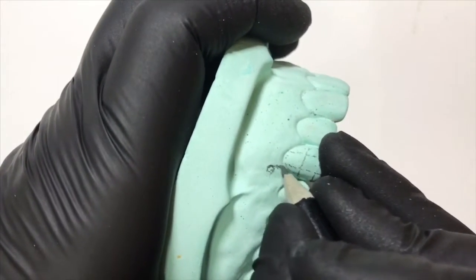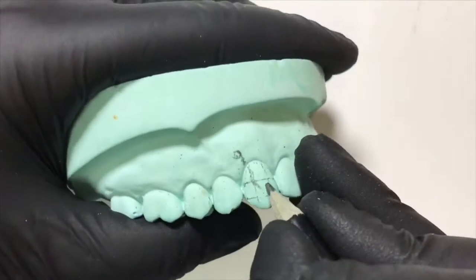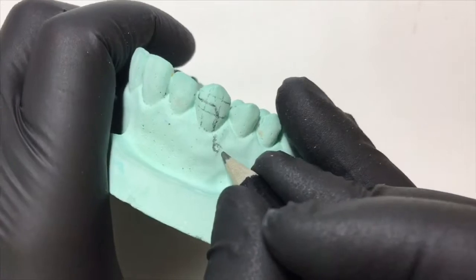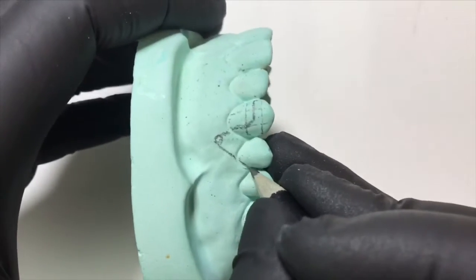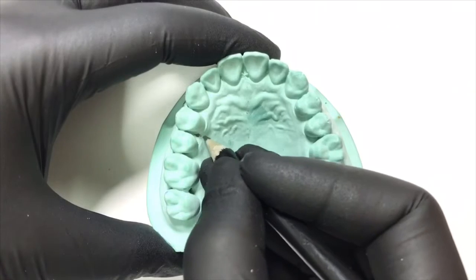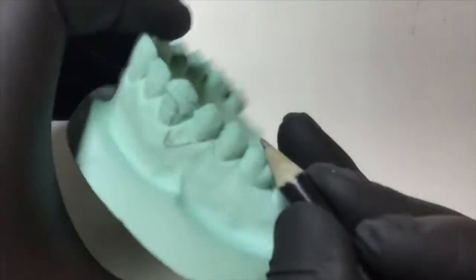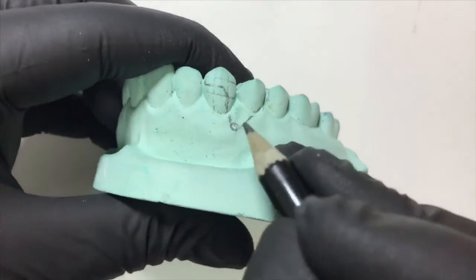The active arm should be in the middle between the incisal and the middle third — that is the point where our active arm would be. It will go and engage in the embrasure between the canine and the lateral incisor. The retentive arm would follow the embrasure distal to the first premolar, then cover the palatal aspect and finally the palatal tissue. These are the markings of the buccal canine retractor.